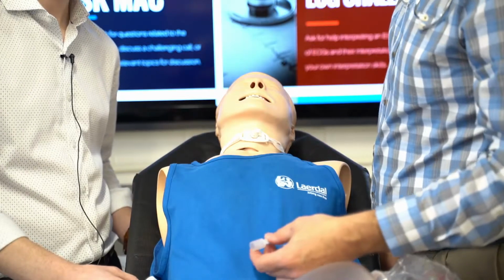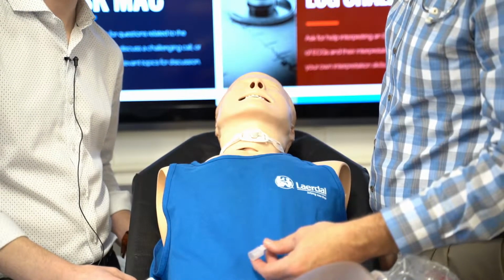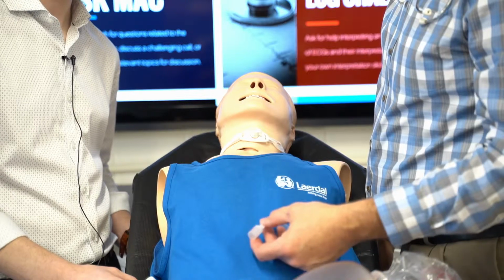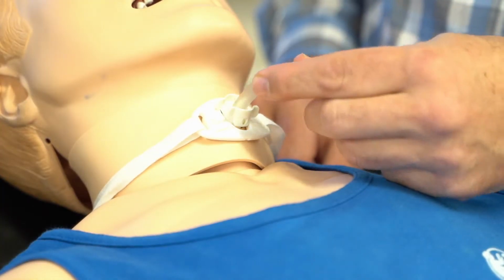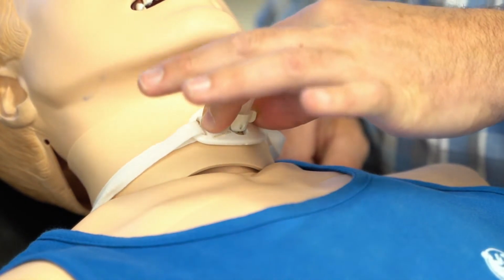So as we previously noted with our other tracheostomy patient, some of the 15mm adapters are going to be on top of the inner cannula. So we need to go ahead and have this in place in order to provide positive pressure ventilations.